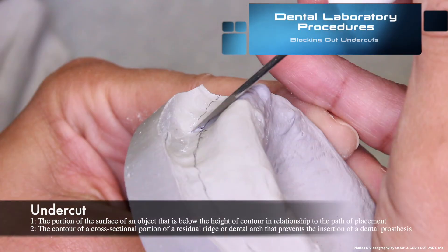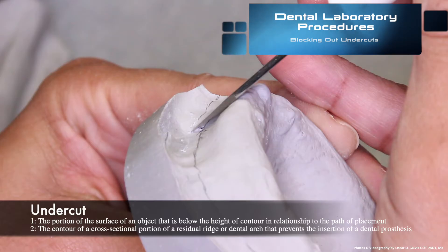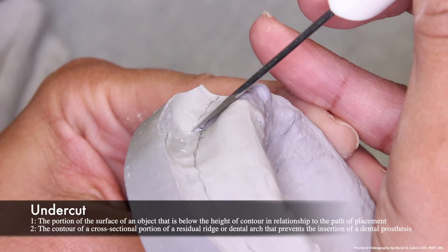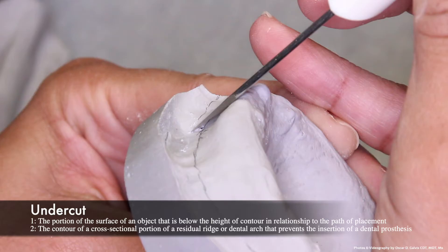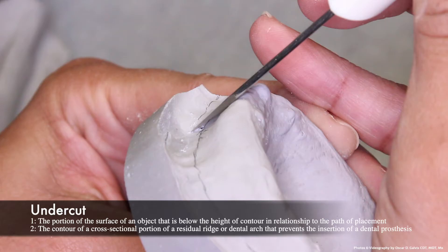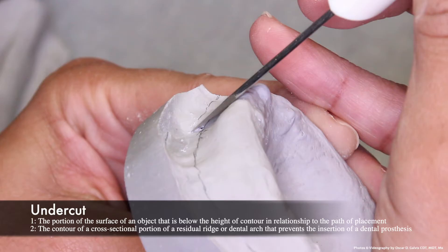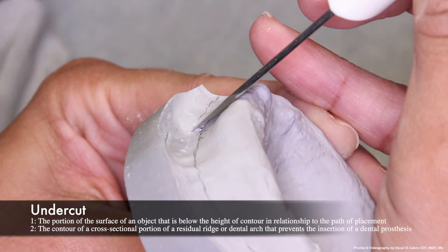The next step in custom tray fabrication is blocking out the undercuts. First, we'll define undercut. Undercut can be defined as the portion of the surface of an object that is below the height of contour in relationship to the path of placement. It could also be defined as the contour of a cross-sectional portion of a residual ridge or dental arch that prevents the insertion of a dental prosthesis. In this photo, we see a Murphy knife held up against the facial portion of the residual ridge on the maxillary cast. The space that exists underneath the residual ridge in between the knife and the cast is an undercut. The knife rests on the height of contour of the residual ridge and the space that occurs underneath is your undercut.